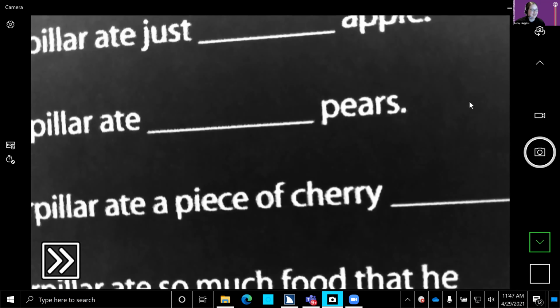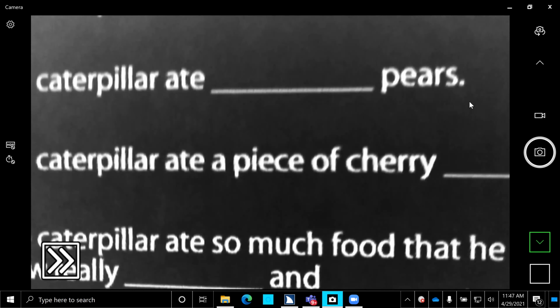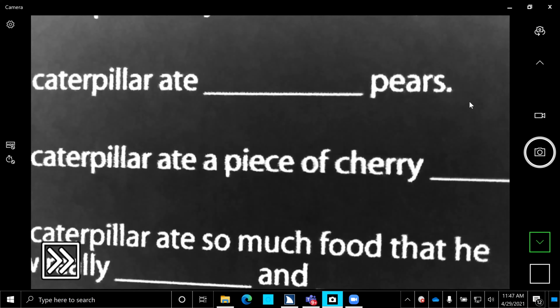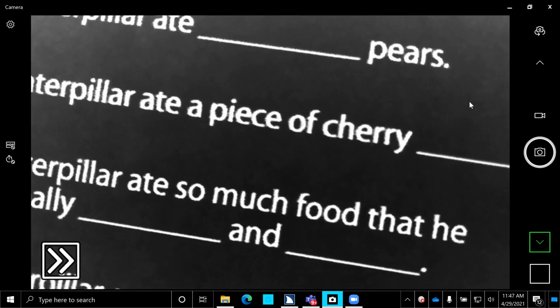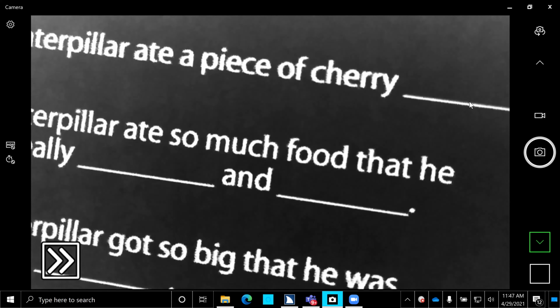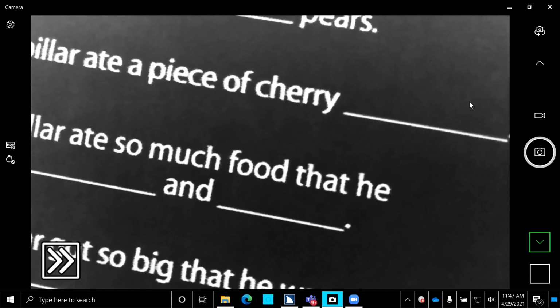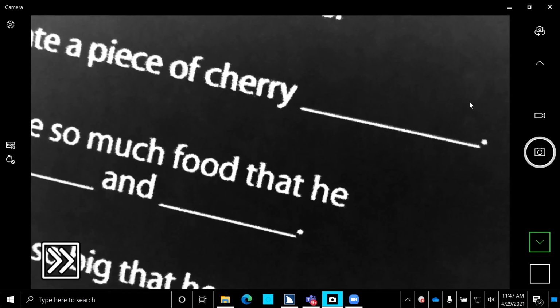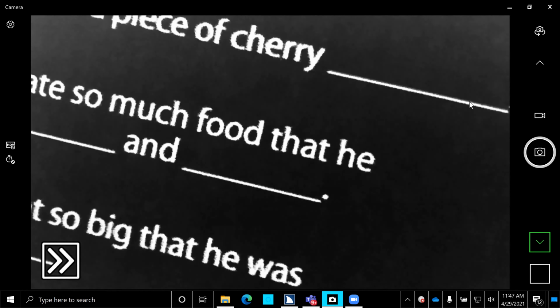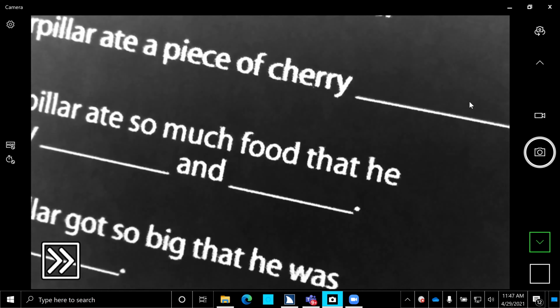Here we go. So in preparation for Zoom failure, I also scanned a page ahead of time. If this fails miserably, because I've got 3 cords connected to my Juno and in my head right now, it is possible that the OCR will not do well. That's not a symptom of Juno. That's a symptom of my environment, unfortunately. I'm trying to get it to run through this capture card and things.